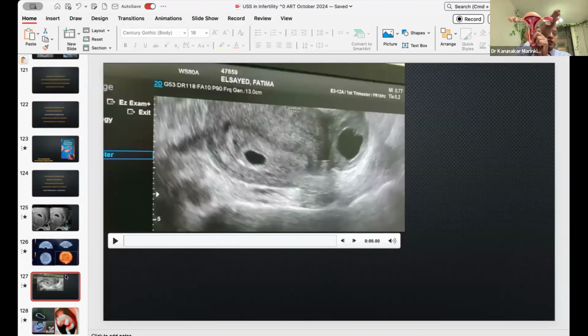You always start from the left iliac ovarian fossa vessels and come up to the right ovarian fossa pelvic vessels. You know the ovarian fossa, which is made of the internal iliac artery, beginning of the superior vesical artery, beginning of the uterine artery, crossing of the obturator nerve, and entering of the ureter from the abdomen to the pelvis. You need to know ovarian fossa anatomy. Your scanning should start right ovarian fossa to left ovarian fossa, east to west.